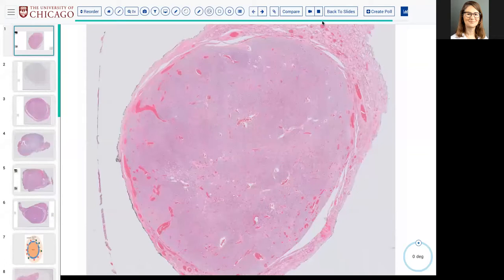Awesome. So these are all thyroid tumors in adults. I can send out the specific clinical histories as well as the link to the extended presentation and the recording when this is over, of course. But this is essentially a similar thing to the interactive microscopy session that I'll be giving at USCAP this year. So it's good practice for me, and I think it's good for you guys to see what goes on out there.